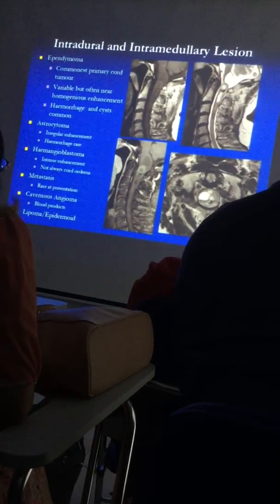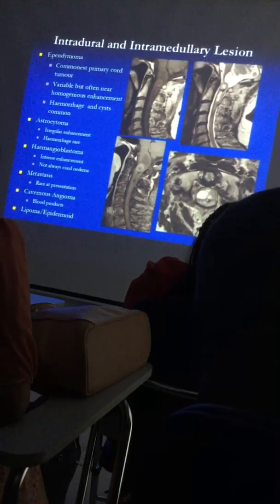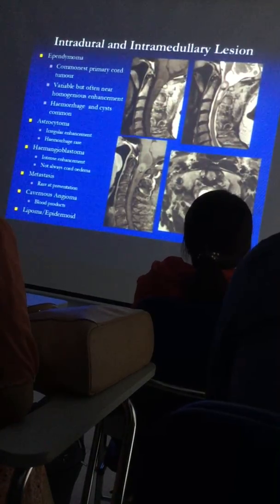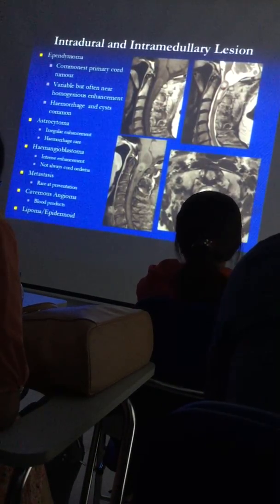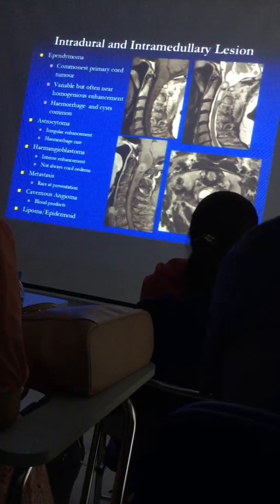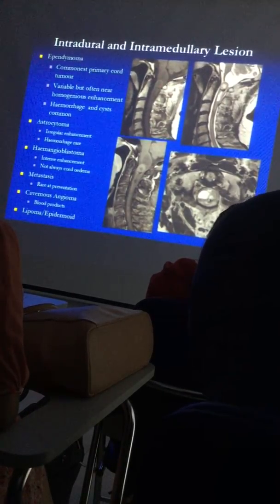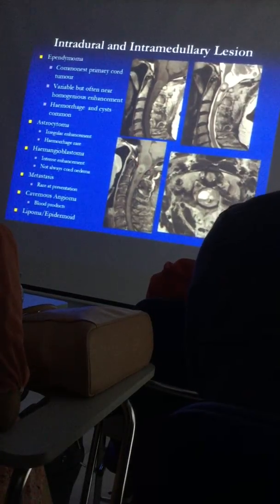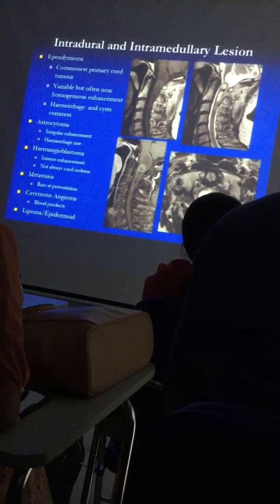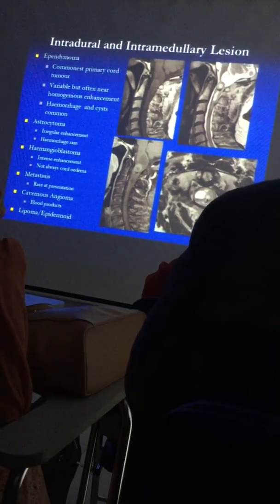Okay, so this is more typical of what we see in an ependymoma. This is the sagittal T1, and you can see there's heterogeneous increasing intensity with the T1s, and it's heterogeneous on the T2s as well. The cord is expanded. There's an adjacent cyst which is also intramedullary, with this central component here causing some minor contrast enhancement. And the dark areas here are also blood breakdown products.